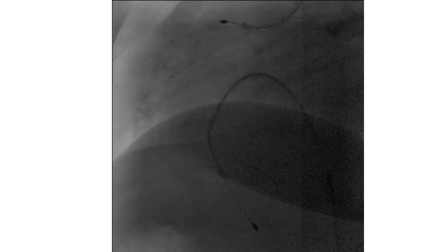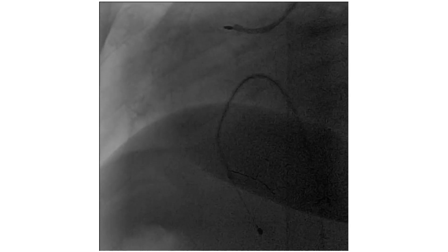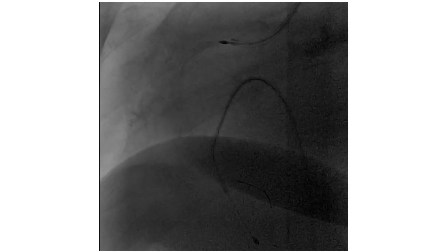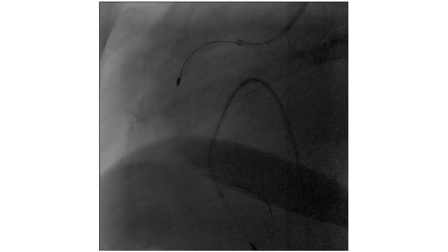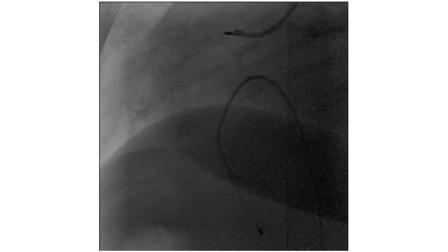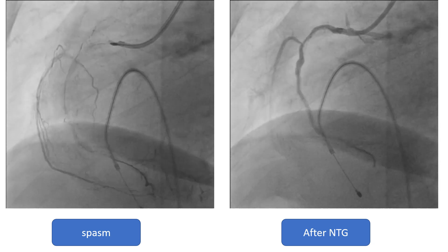This is the first run — you can see the pecking motion performed using the advancer. Still in the first run, we can see the lesion is not yet crossed. Several runs were required, and here we can finally see the lesion crossed by the burr. A pacemaker was used because the patient had severe bradycardia — pacemaker use is typically indicated for RCA and dominant left circumflex procedures. It is not unusual to get a spasm with rotablation, and this can be easily resolved with nitroglycerin, as seen in this case.